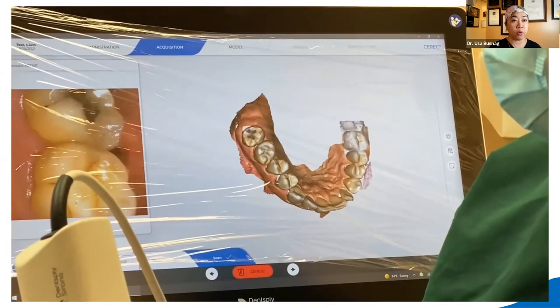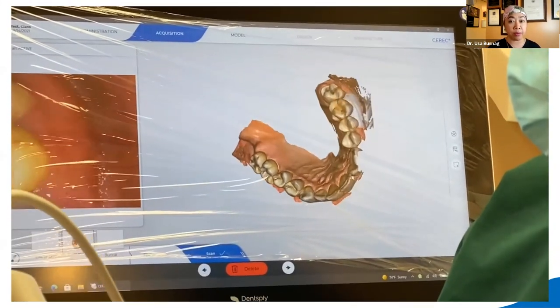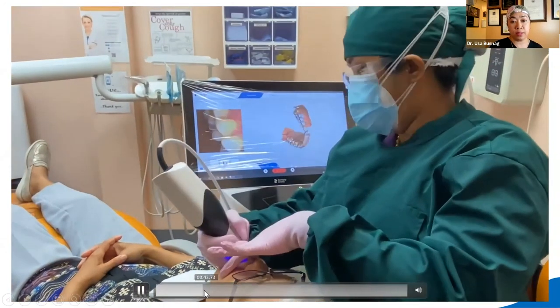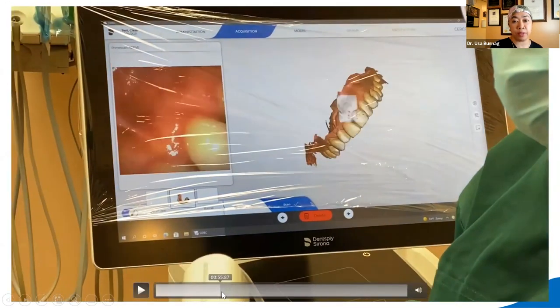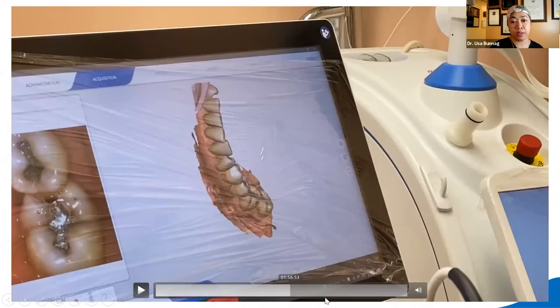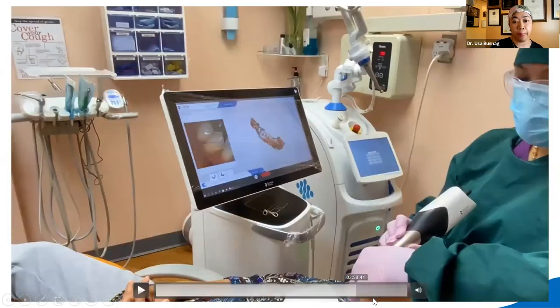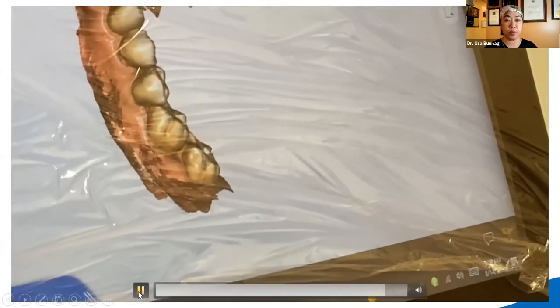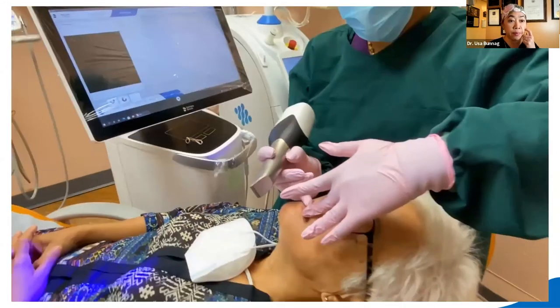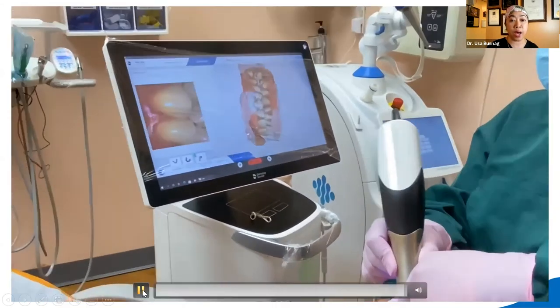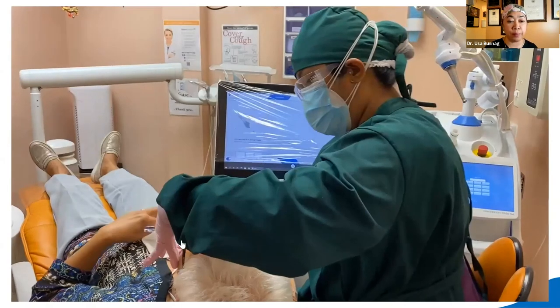The Prime Scan is a touchscreen, it corrects mistakes automatically, and it's just so much faster. For the night guard scan, you scan the same way, but for the buccal bite you have the patient bite on two cotton rolls to register the desired bite position. Then you upload that file to Sprint Ray.